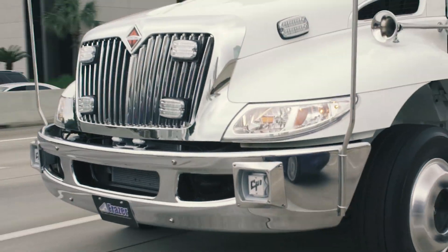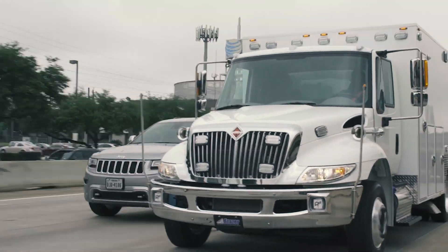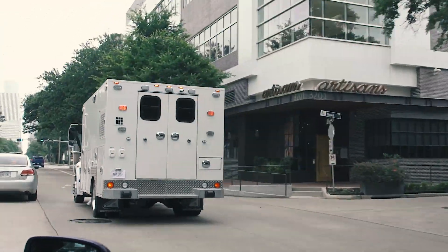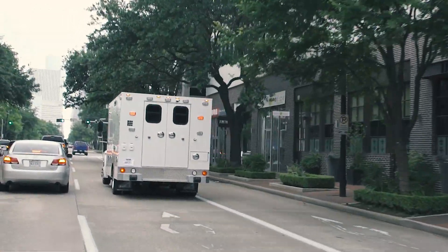As more and more mobile stroke units make it out there around the country and around the world, it's an unfortunate reality that one of them may be involved in an accident at some point. We're trying to prepare for the worst-case scenario by keeping the safety of everybody in mind.